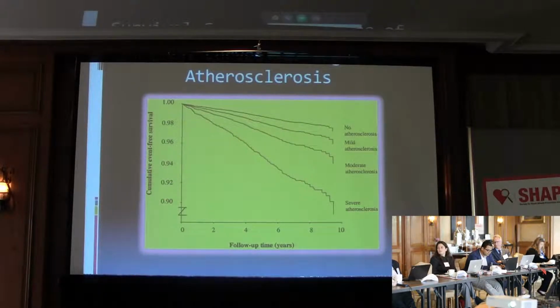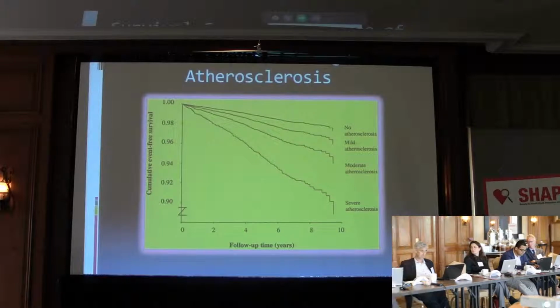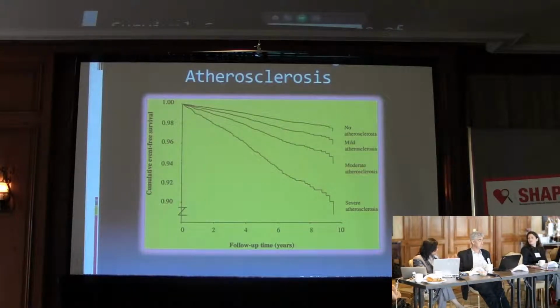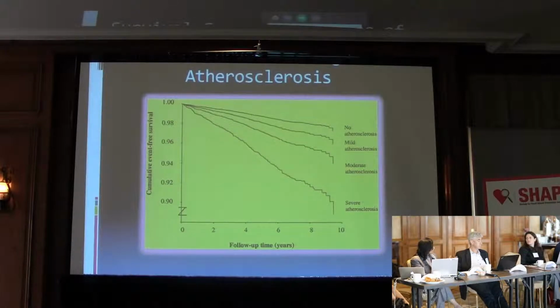So it is far more true that if you have zero calcium, you're going to find atherosclerosis by ultrasound. The reverse is also true, that there are some patients who will not have carotid plaque but will have some coronary calcification, but the percent of people who are missed as having atherosclerosis by carotid ultrasound and have a CAC of more than 0 is much lower than vice versa. And this has to do with the pathogenesis of atherosclerosis that I showed you by the whole body CT.